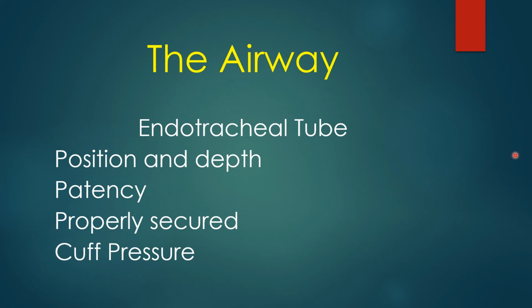And of course, the airway, we're monitoring the airway. So the endotracheal tube, there's a lot of things we need to look at when we check the endotracheal tube. One, we want to look at the position and the depth. You want to see if it's on the left side of the mouth or on the right side of the mouth, and we should change it from the right side to the left side pretty frequently. Your hospital may have a policy, every 4 hours, switch it back and forth. The more often, the more comfortable it's going to be for the patient.